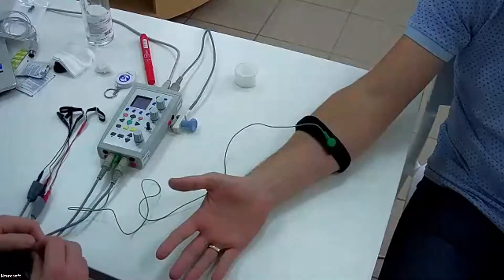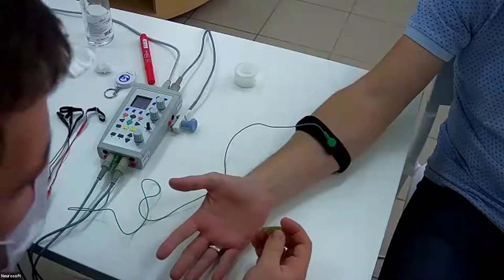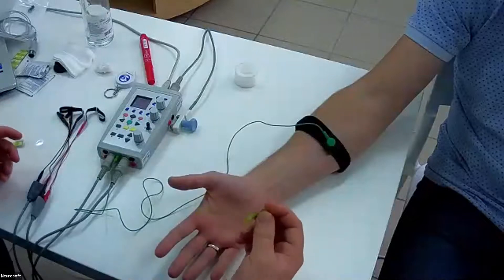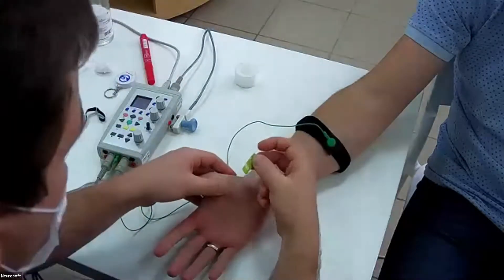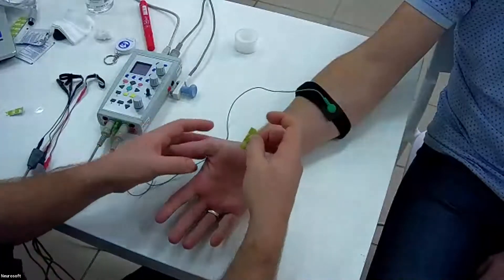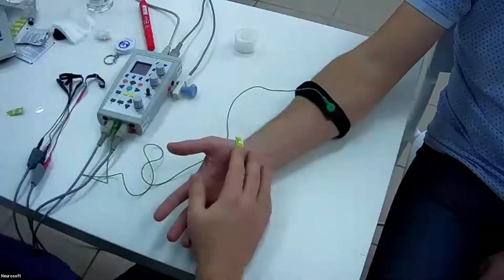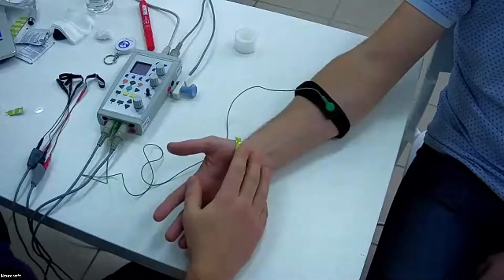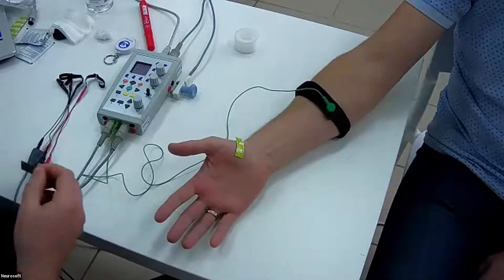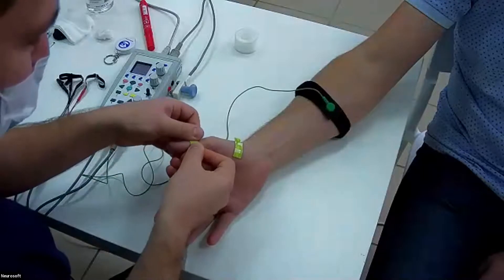We will apply the recording electrodes. There are two electrodes: the active electrode E1 is set at the thenar eminence — the muscle belly of the abductor pollicis brevis — and the second, the reference electrode, is set at the thumb.